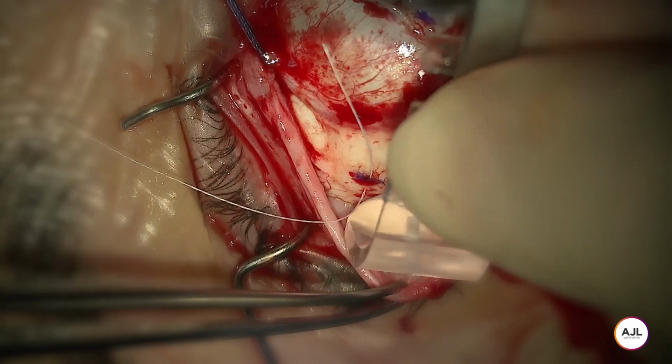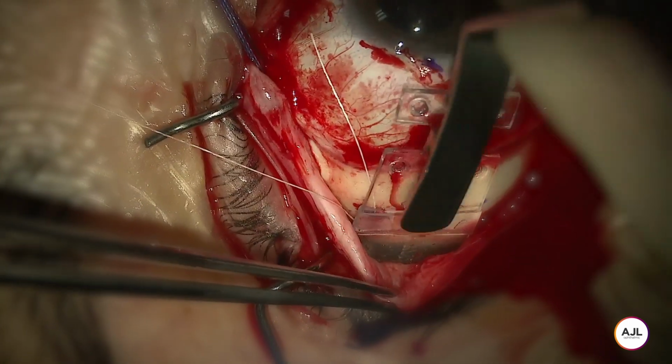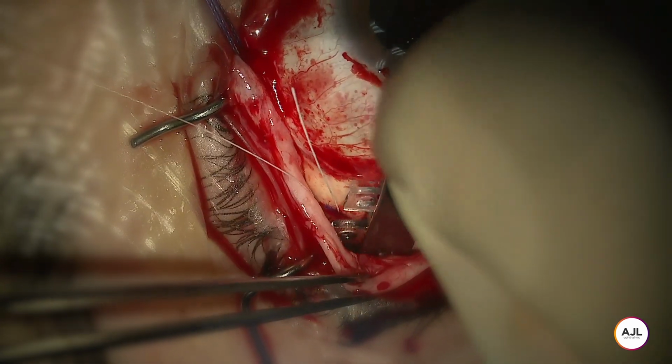The NPB connected to the loading device is inserted into the supratemporal quadrant. One hand holds the loading device, while the other hand pushes the head of the NPB with the thumb into the retrobulbar space.